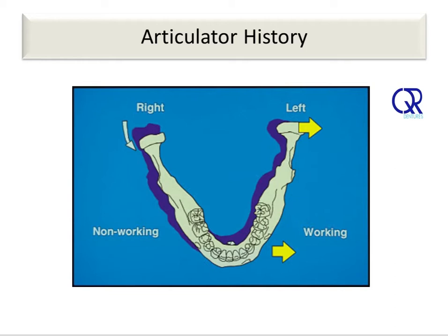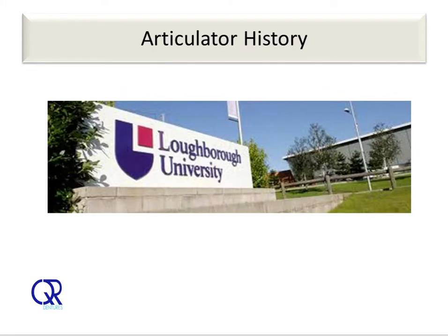Today's articulators cannot represent true mandibular movements in these important respects. Fortunately, the study of dental occlusion and its relationship with mandibular function is progressing. There is now research evidence that compensating curves, such as Von Spee and Wilson described, do not exist in nature. This is also supported by full denture wear pattern observations from our clinical work.